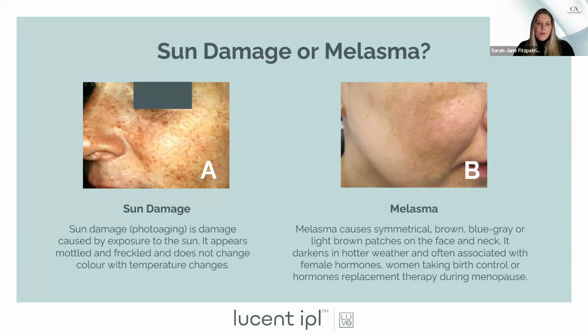And we have two more questions. For those that are asking questions around vascularity, we will get to that section and then I will ask your questions. So the one question here, Teresa, I'm going to ask it as a two-parter. For melasma, how frequently should we treat, one shot and done? And the other question is, melasma, treat only once. Can you elaborate?